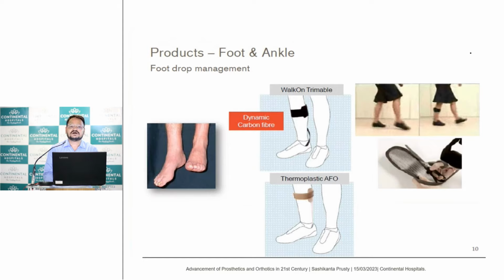For foot and ankle, this is a very specific ankle foot orthosis. This is a carbon fiber design that is readily available. Normally it is used in cases where we see there is no chance of recovery.